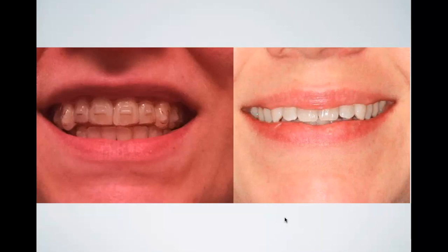And so you can actually engage more of the undercuts of the teeth without sacrificing the movement of the teeth and without creating a scenario where they can't get it off their teeth. And so there's 2 materials out there right now that you can do that with. One's called Graphy and another one's called Lux Creo. Do you guys have experience with either of those ortho resins? Do you guys get to play with those at all?